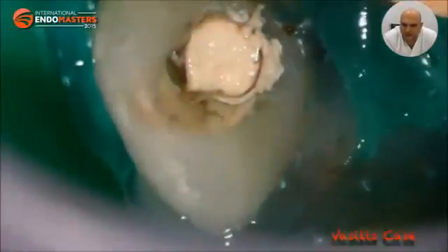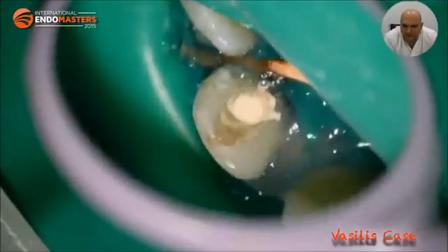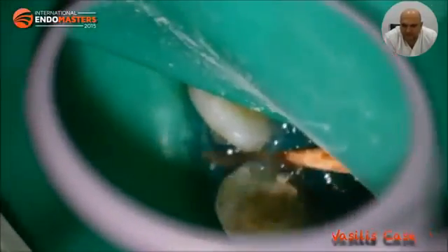The first shot of Biodentine here was placed again with the amalgam carrier used as a Biodentine carrier. This is the first shot of Biodentine. You see that it's inevitable to be mixed with the blood. The second shot will be thicker, the third shot will stay there. You can wait 12 to 15 minutes for Biodentine to set. However, in this case, I placed a temporary restoration and rescheduled little Vasilis.